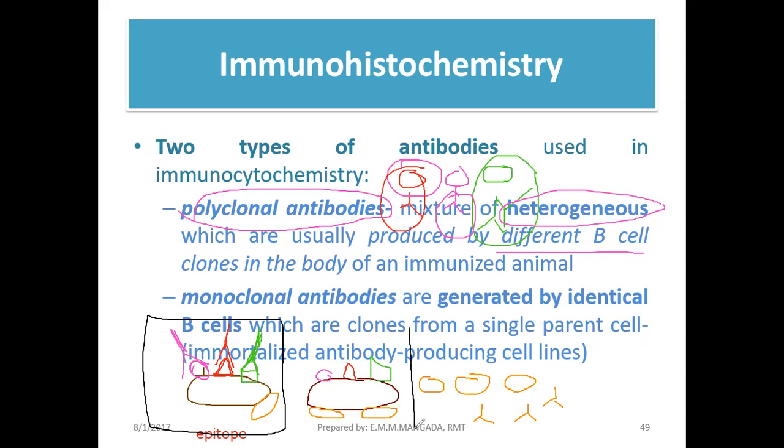If for example, dito naman ang ginamit natin ay monoclonal, since pare-pareho sila, these antibodies, you will just see binding dito sa may orange. Kasi orange yung antibodies mo. I'm referring to this, hindi ko kasi napalitan yung kulay. Hold on. Ay, sorry. Okay, this one. This we have your monoclonal antibodies, right? So they will bind now in this epitope. Kasi orange sila. So yung monoclonal antibodies natin, iisa lang, identical.